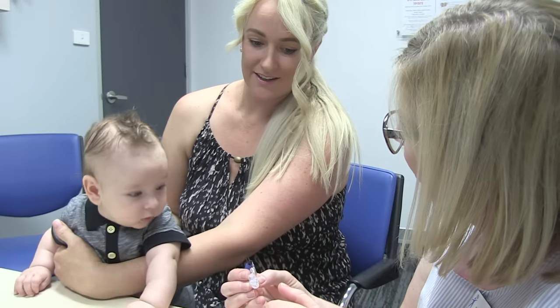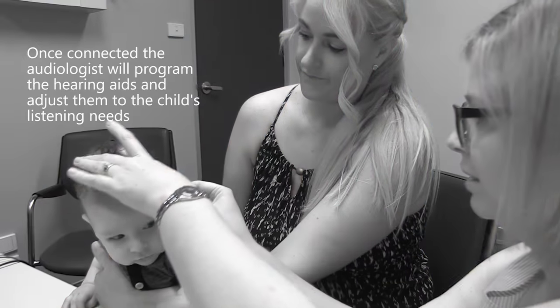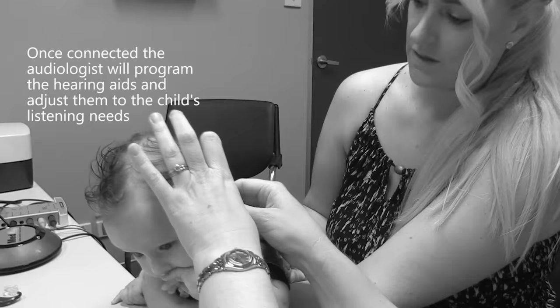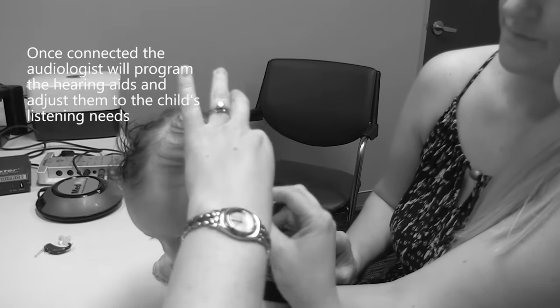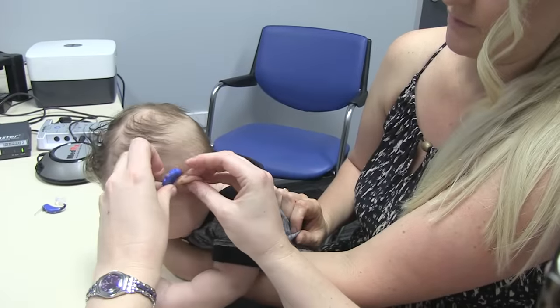So what we're going to do now is put the hearing aids on and turn them on. Yep. There is a slight startup delay — it's about six seconds before they turn on.